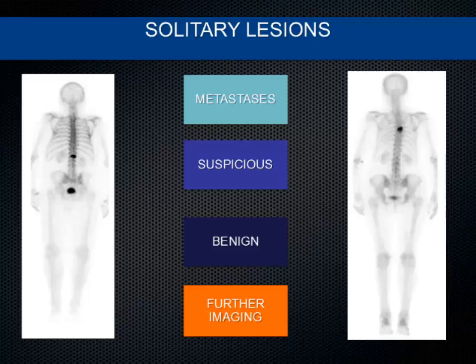The more we read, the more confused we become. And then the clinical question is whether this is mets, and some will say this is suspicious for bone metastasis, and some will sit on the fence, saying it looks benign, but I would like to have further investigations to confirm whether it is benign or malignant.